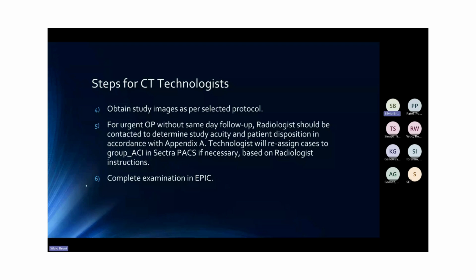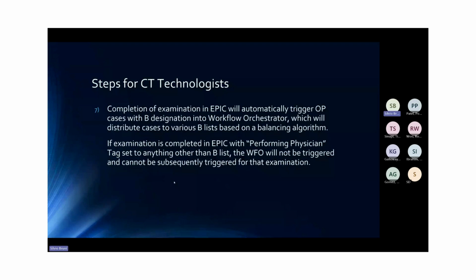So completing the examination in Epic, going from in progress to unread status, will automatically trigger the WFO for cases that have been designated as B for performing physician, and then those will be distributed.